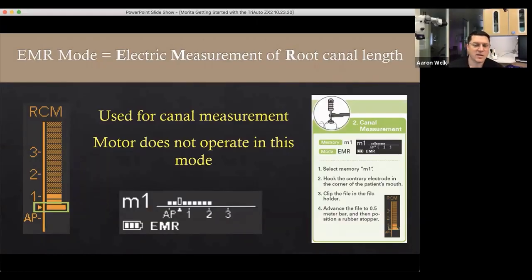The M1 setting is your apex locator mode. There are two visuals on screen: a vertical visual on the left and the M1 display at the bottom. As you use the handpiece, it transitions from the M1 screen to the RCM apex locator grid. As the file advances into the canal, that grid populates, and when you reach the triangle circled in the green rectangular outline — just above 'AP' — that is your endpoint, your minor diameter reading.